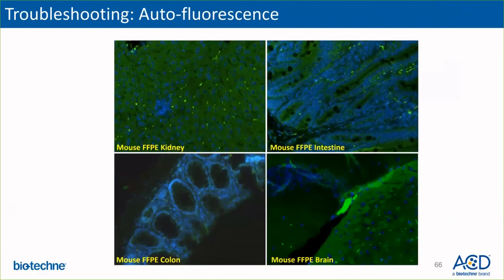One known issue with fluorescence assay is that due to long fixation time, FFPE samples are prone to inherent autofluorescence, which poses challenges for image analysis. You can use FFPE if you have background correction software to reduce autofluorescence, and alternatively, we have now developed a multiplex fluorescence version 2 assay that helps to address this issue. If you are still experiencing autofluorescence issues with your assay, please do contact technical support.